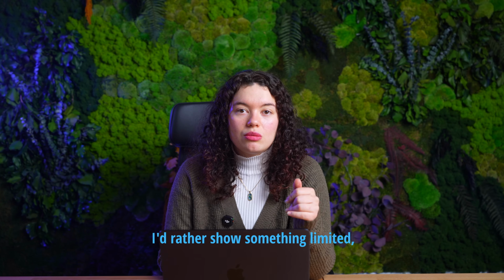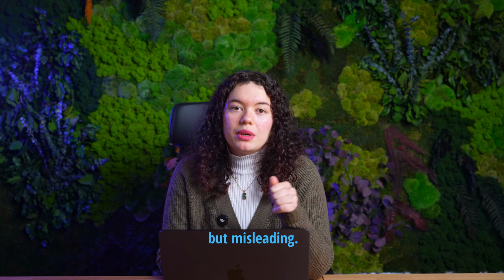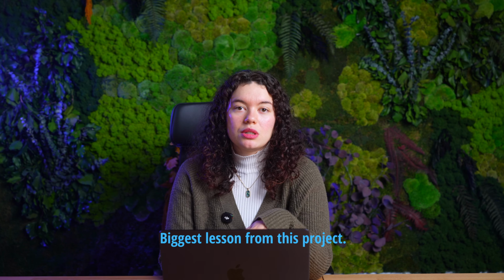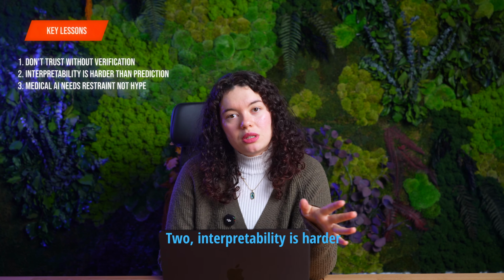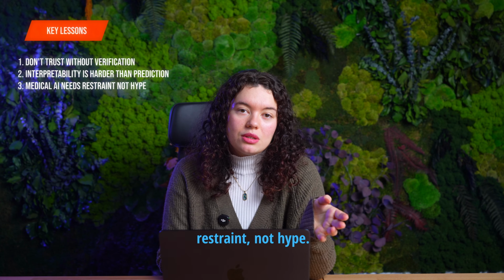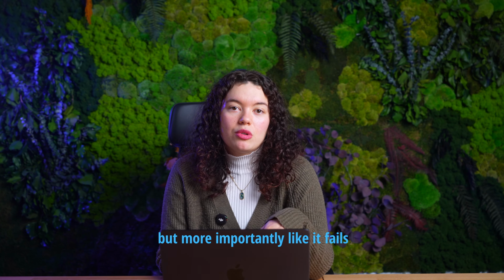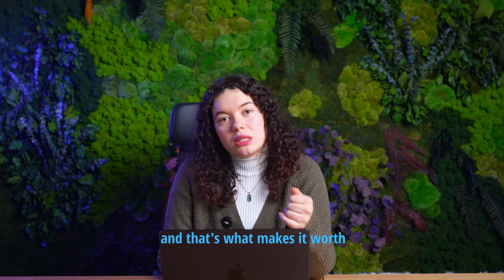I'd rather show something limited but honest than something impressive but misleading. Biggest lessons from this project: 1, don't trust the visuals without verification. 2, interpretability is harder than prediction. And 3, medical AI needs restraint, not hype. So AutoScanAI works, but more importantly, it fails loudly when it should, and that's what makes it worth building.